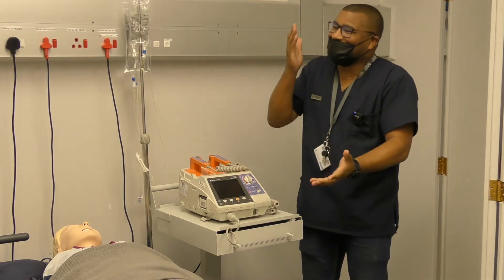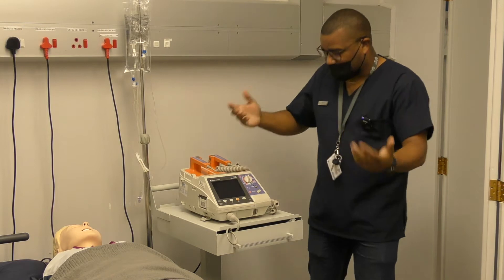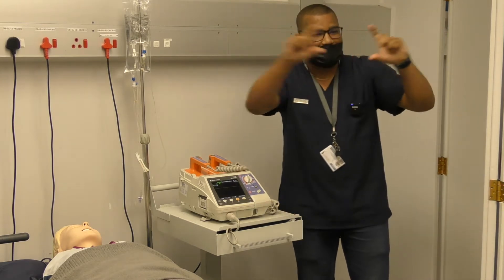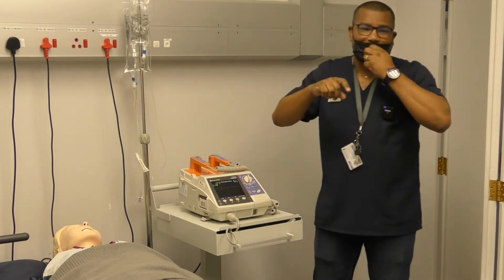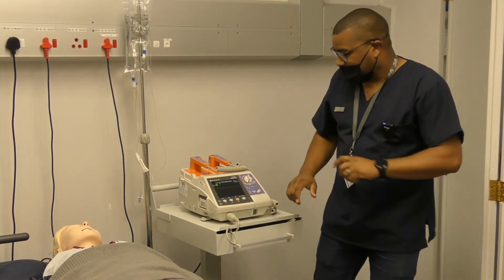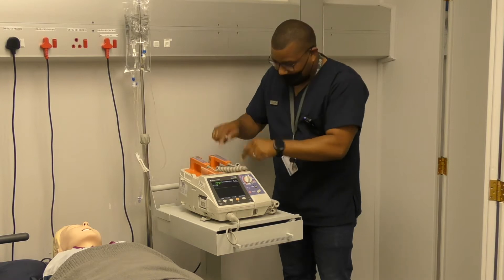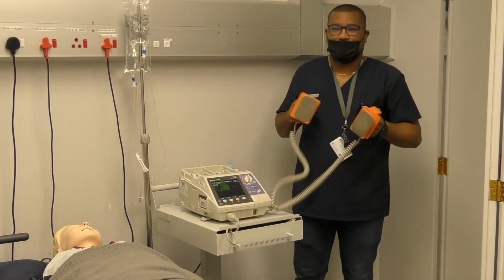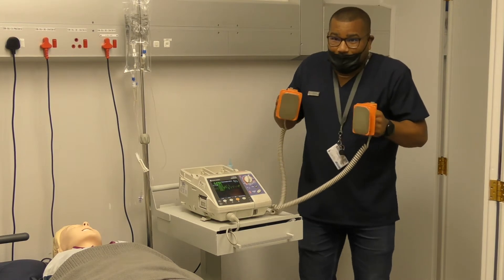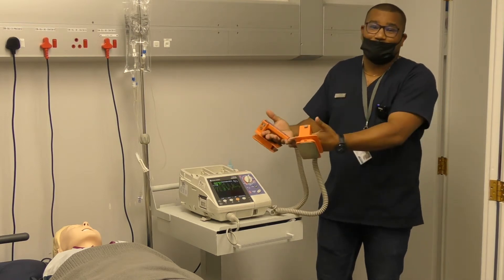Let's say we switch on the machine — you'll see it's now on monitor mode, and there are alarm settings you can configure so the alarm will go off once readings exceed your set parameters. You'll also see that once you switch on the monitor, the default setting is paddles. So if I pick up the paddles and do this, you may think you see VF on the screen — but it's not VF, it's just interference because the device is set to paddles.